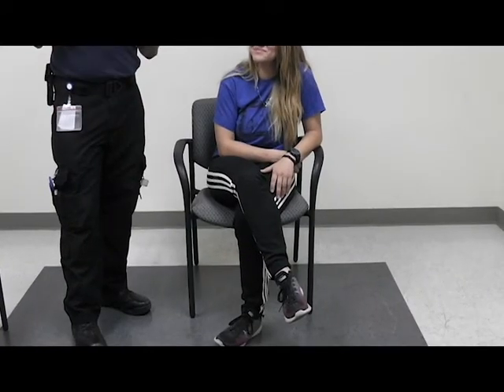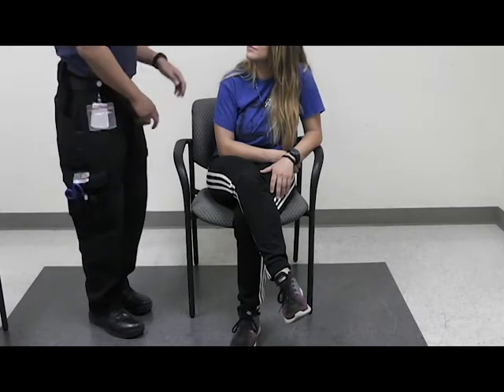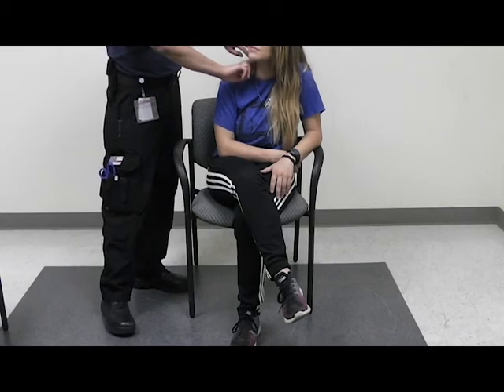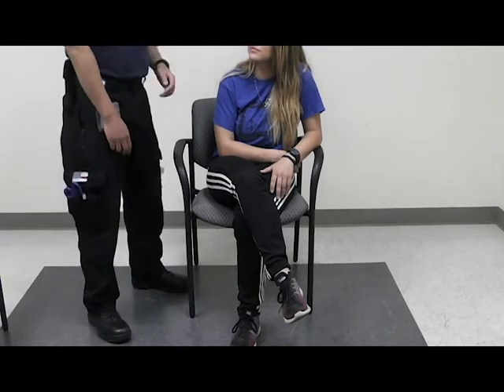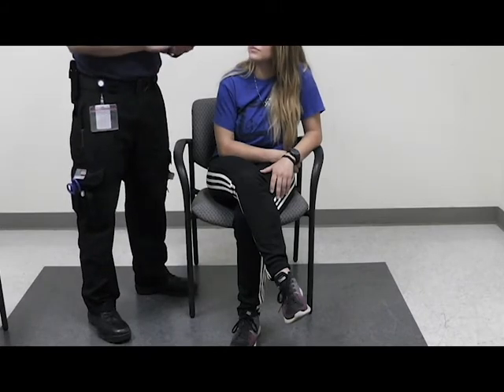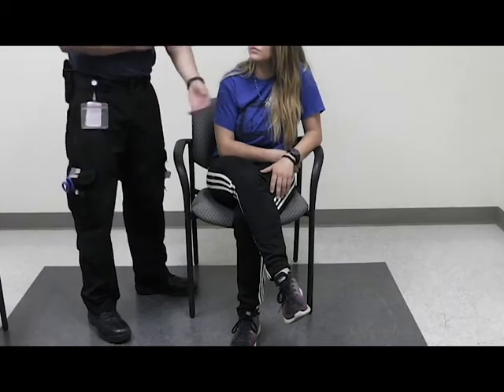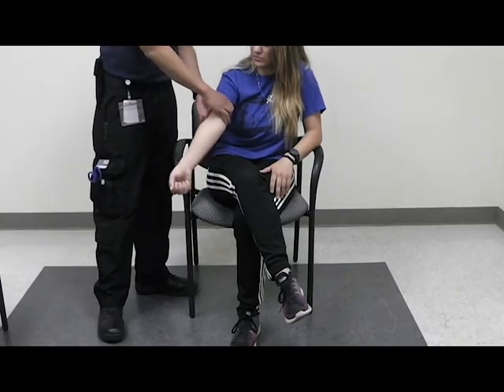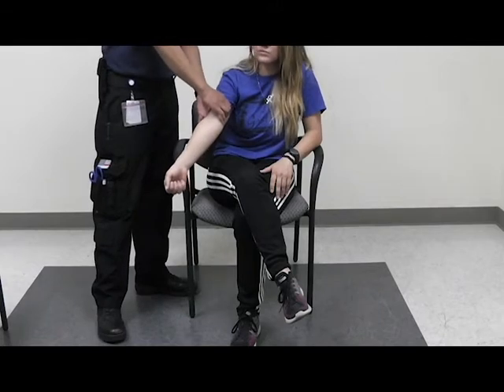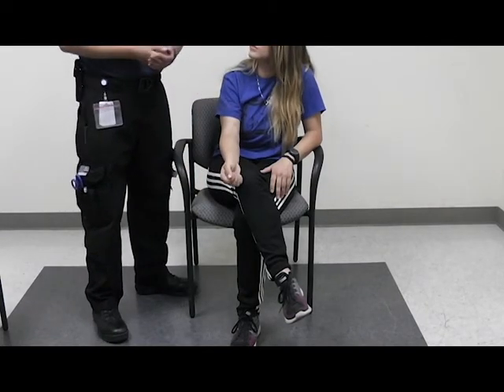This is a demonstration on how to obtain a heart rate on a patient. There are several places you can obtain a heart rate. You can go for the carotid artery, which is on the neck — use two fingers and feel for a pulse. It's important to take it on the side of the patient so you're not reaching across them. You can also take the brachial, which is on the inside of the arm. This is ideal for pediatric patients.